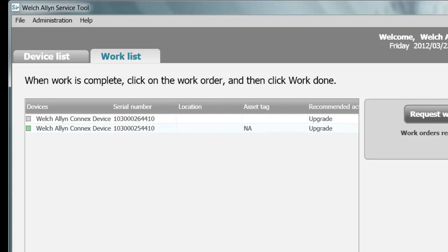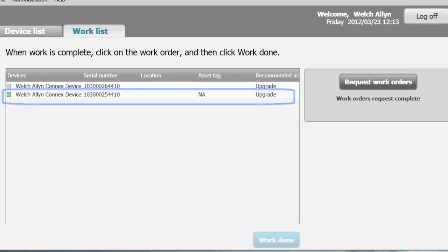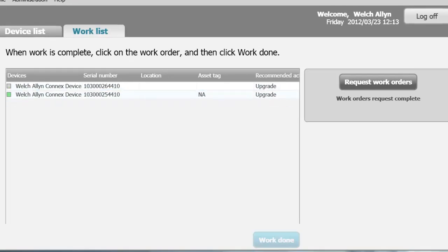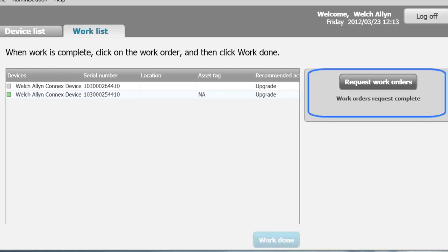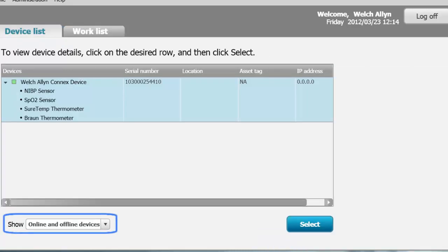When you or a technical staffer performs the work, highlight the device row and click Work Done to delete the task from the Work List. When you click on Request Work Orders, the Service Tool reaches out to the Partner Connect system and asks if anything is available for your maintained devices or the connected device. Click on the Device List tab. A drop-down on the bottom left of the page allows you to select which devices you would like to have in your list.